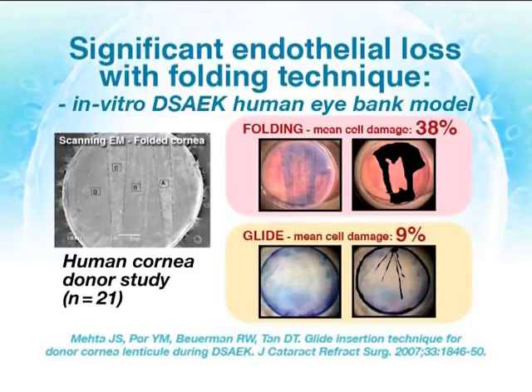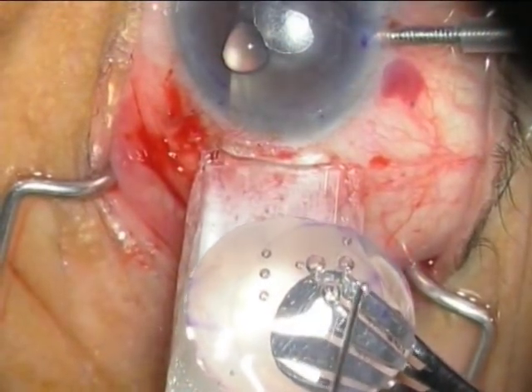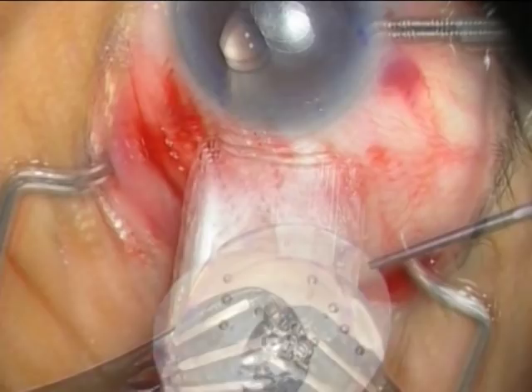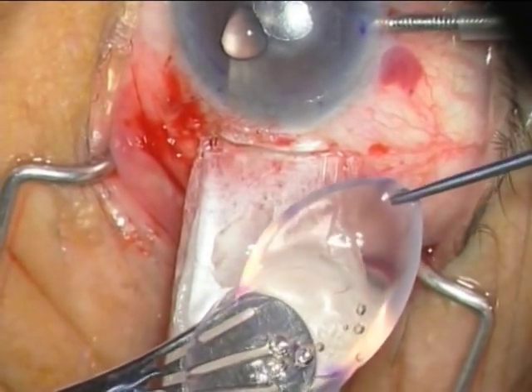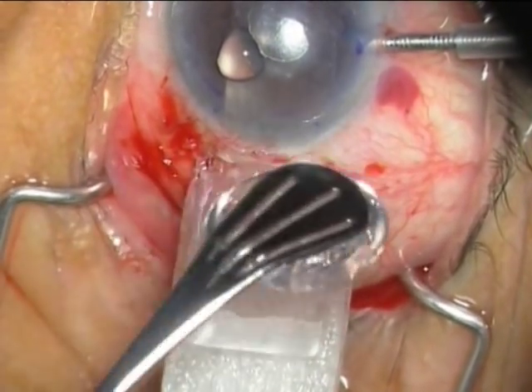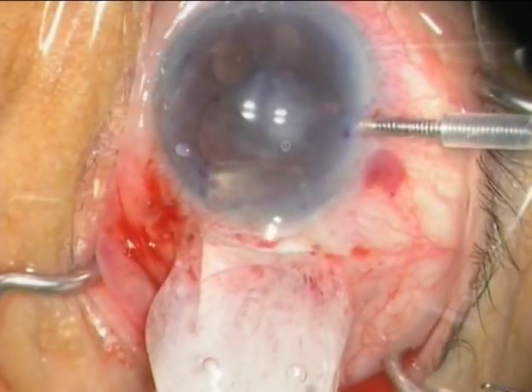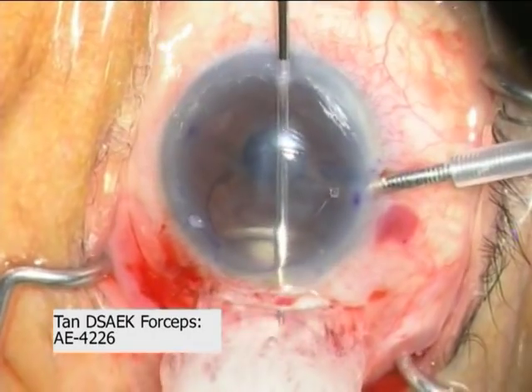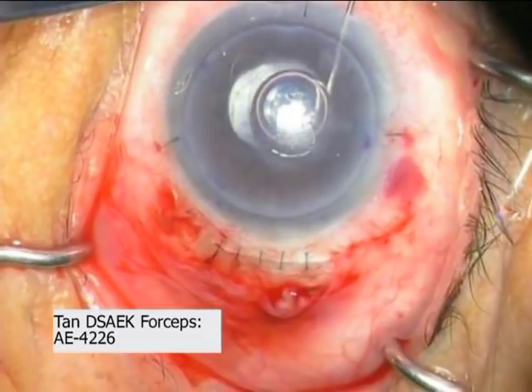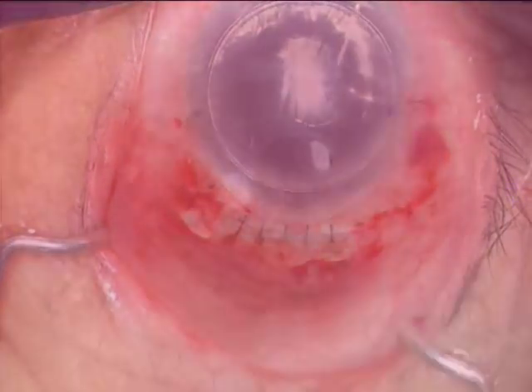In this video of our technique, the modified sheets glide is first inserted through a 5 mm scleral tunnel. Copious amounts of Viscoat is then placed on the endothelial surface of the donor, and the anterior lamella is then removed. More Viscoat is placed onto the glide, and the donor is then carefully everted, endothelial surface down, onto the bed of viscoelastic. The Tan forceps is then inserted across the anterior chamber, and the donor is grabbed and simply pulled into the eye. A small air bubble is inserted to keep the donor up, and after wound closure, a full air fill for 8 minutes ensures donor adherence.